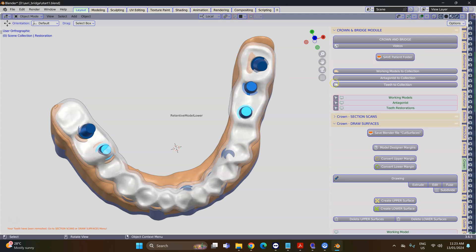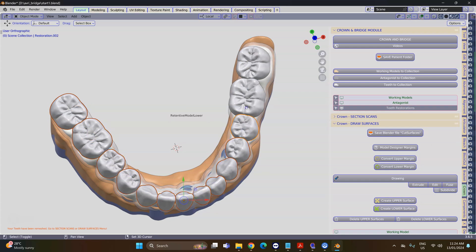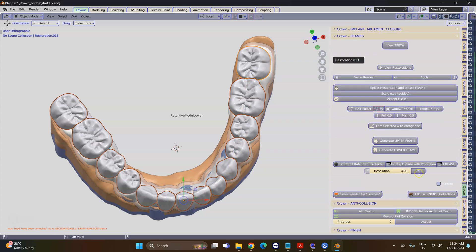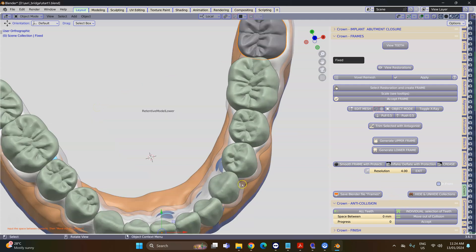Now they've disappeared but they are in the correct collection, which means we can perform this procedure. Going back down to this menu, I'm going to select all of these teeth, and I'm going to select the last one last and click on Individual selection of teeth. All of these teeth will turn green except for the pillar tooth, and everything is going to move away from that gray tooth.